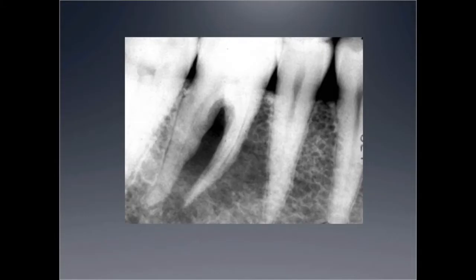Absolutely. Now, this is more of a tricky situation. You have here a lucency, and it could represent an endoperio problem very well. You see something that involves the furcation of the tooth. It's poorly defined, poorly demarcated. And that's one of the dangers in the area. This is a case of osteosarcoma, a very malignant tumor of bone that does this.